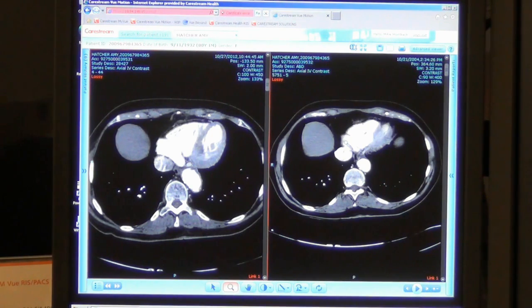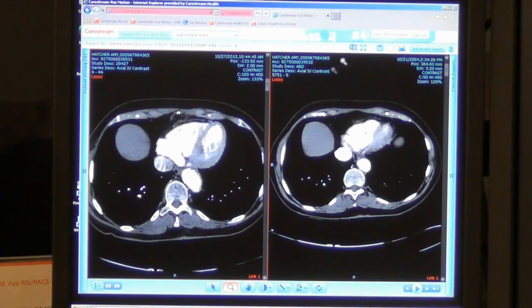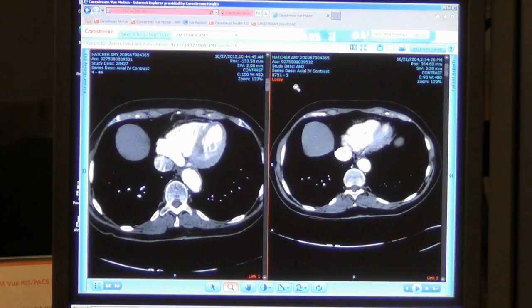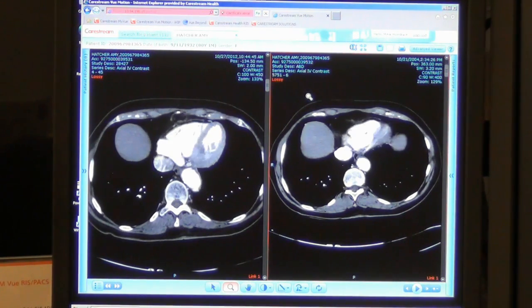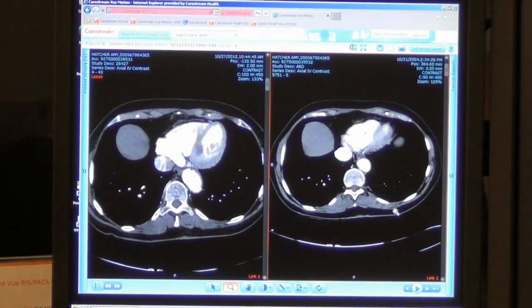The images are displayed in a JPEG 2000 lossy compression format. If I want full resolution, I can decompress this image. The indicator then shows that I've decompressed and now have full resolution in JPEG 2000 format.